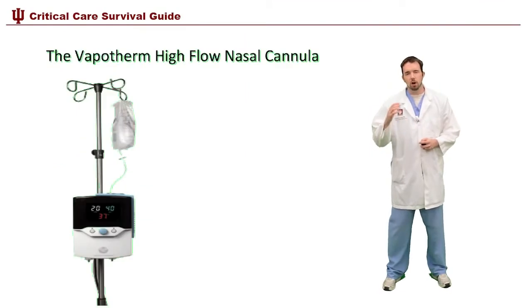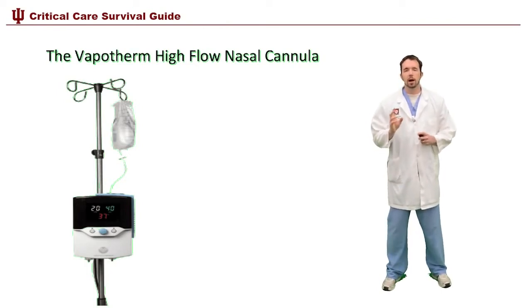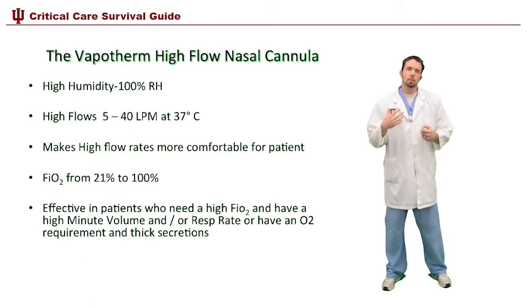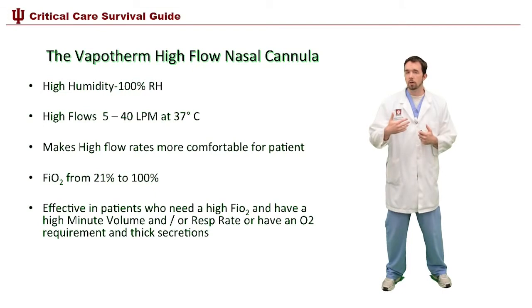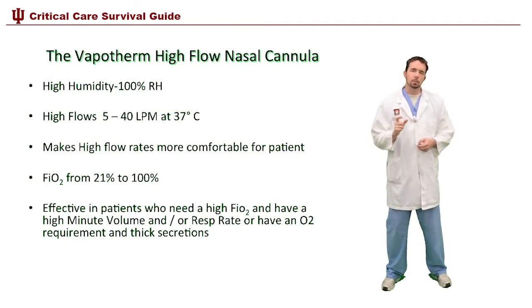The next type of device is also a nasal type of cannula, but it's a little bit thicker, and it's called Vapotherm. Vapotherm is new technology that works by using high humidity oxygen and coupling it with a high flow. And what this enables is a higher FiO2 to be delivered to the patient because their oropharynx and dead space airways work as a reservoir so that when the patient inspires, a higher concentration of oxygen is delivered with each breath. Think of it a little bit like a non-rebreather mask, which I'll show you shortly, where the bag is the reservoir that fills with oxygen.